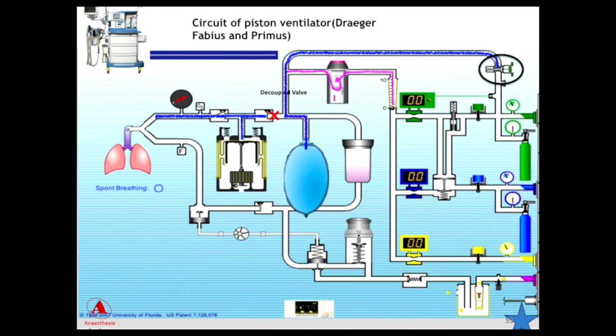We want the bag to be bigger. So we press the flush and we develop this habit. Okay. Here also there will be a problem because the vaporizer is bypassed. So your anesthetic concentration will go down. You had achieved this steady state with a lot of effort with low flow, and you will lose that. So that's a piston based or Dräger machine.